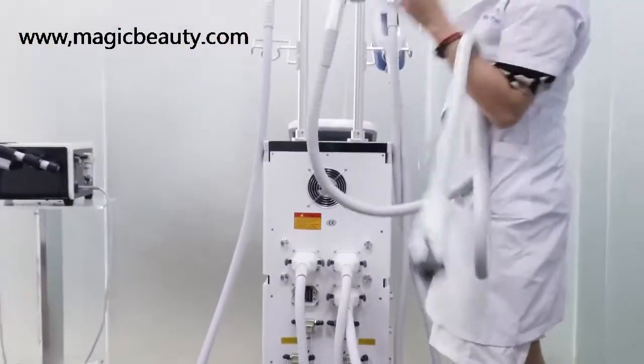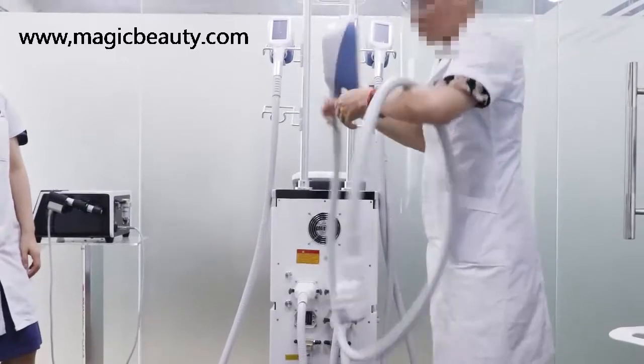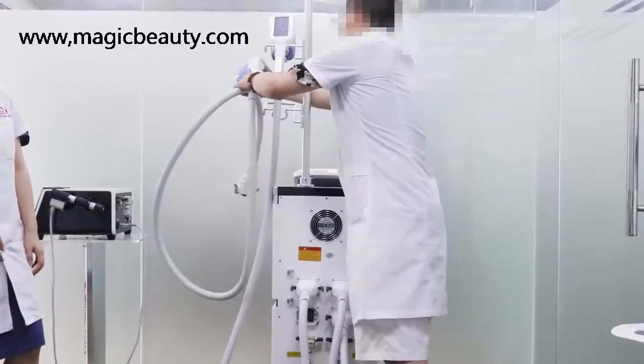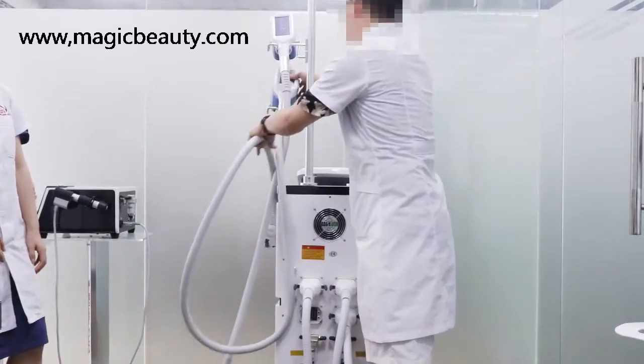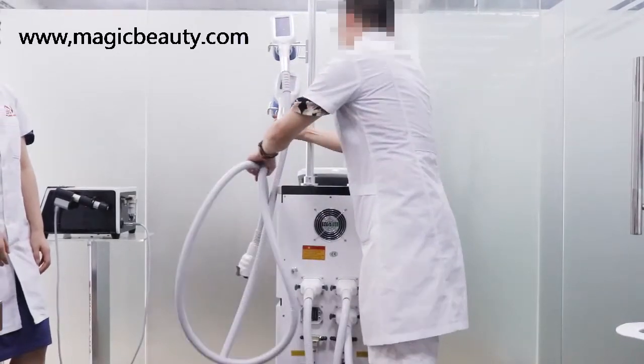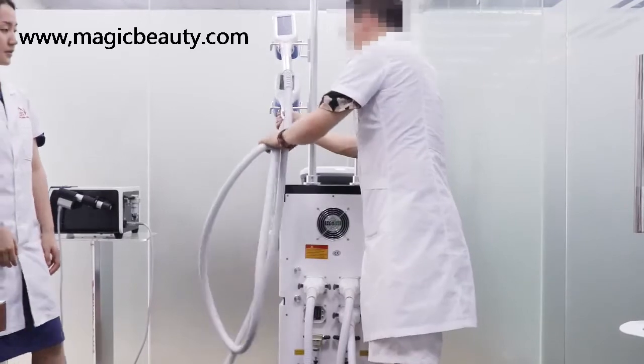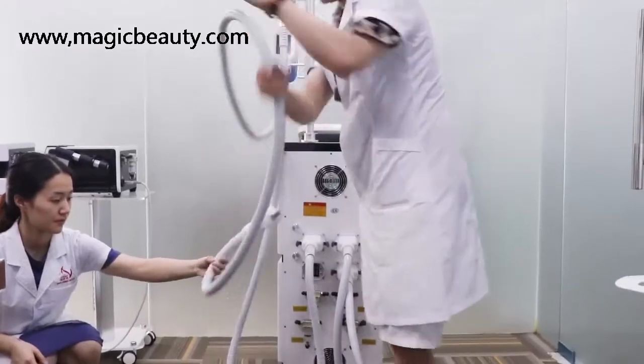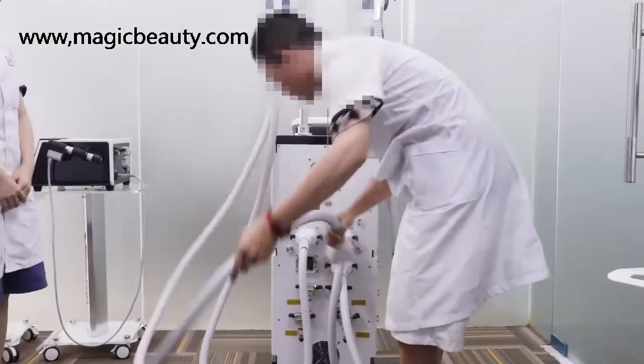This is the fourth handle. The machine can do four handles — it can control four handles working together at the same time. So this is the fourth handle, installed the same way.